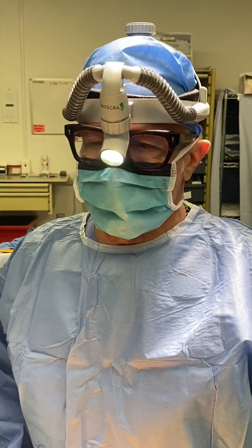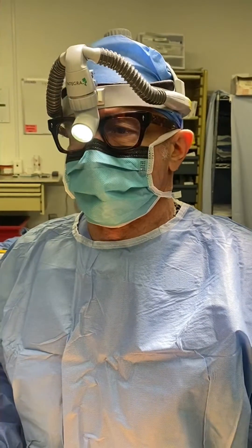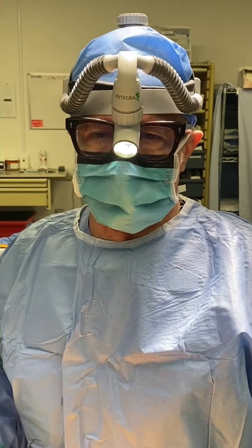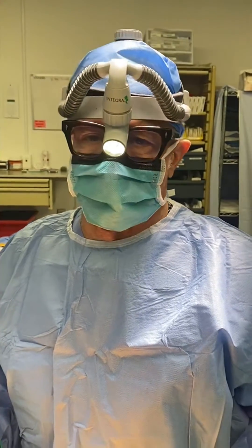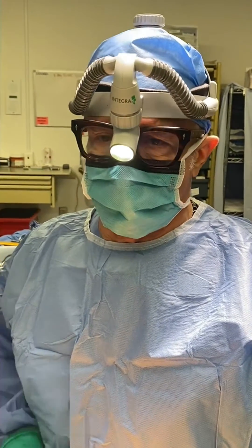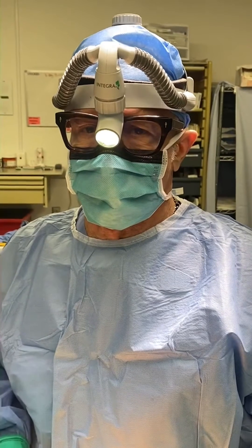There are different ways to fix this. We would rather not have to go through her abdomen again because her vessels are probably scarred to the spine and moving them could be a little dicey. We're going to try to take care of this posteriorly and put screws across the sacrum and into the pelvis. They're called S2AI screws.